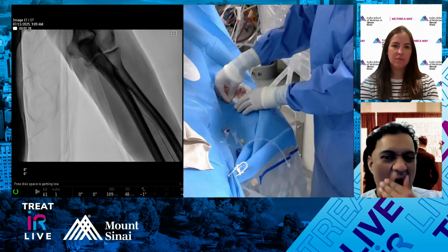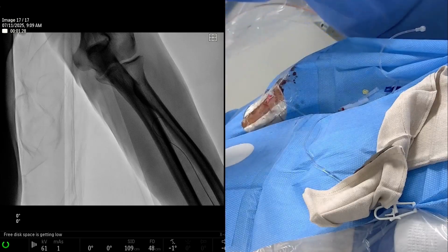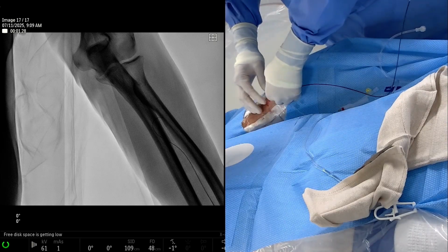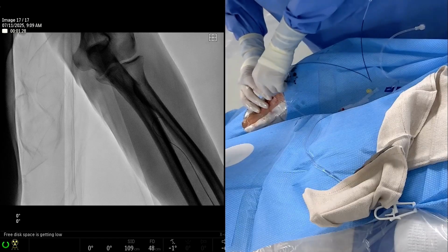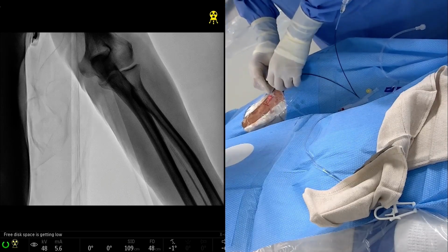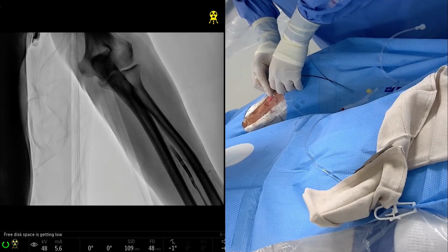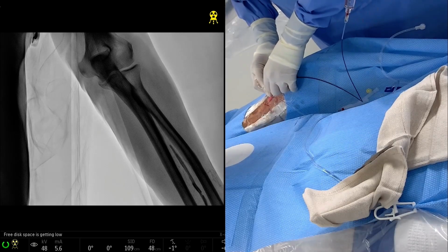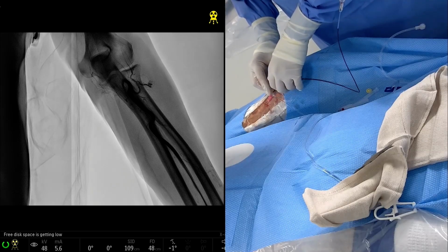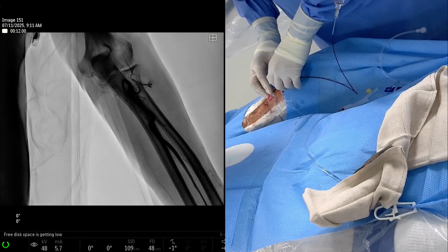When we first started doing radial, we did an experiment where we pre-op ultrasounded 50 patients to look for a radial loop, and we didn't see any, so we stopped doing it. And how do you explain to everyone what a radial loop is, how you can get in trouble with it, and how do you navigate around it? And I go forward. It looks like our sheath is a little occlusive, but that's okay. It's actually not so bad, right? It's just tortuous. It's not really a loop.